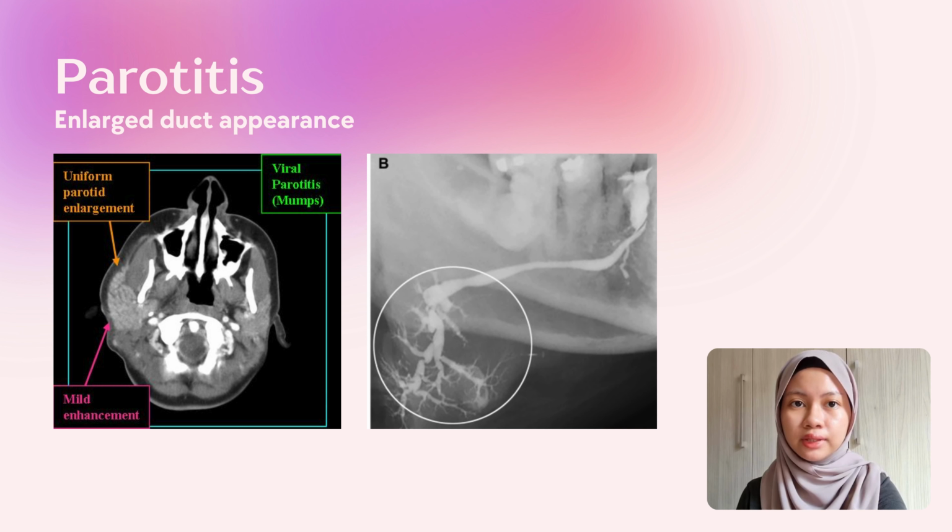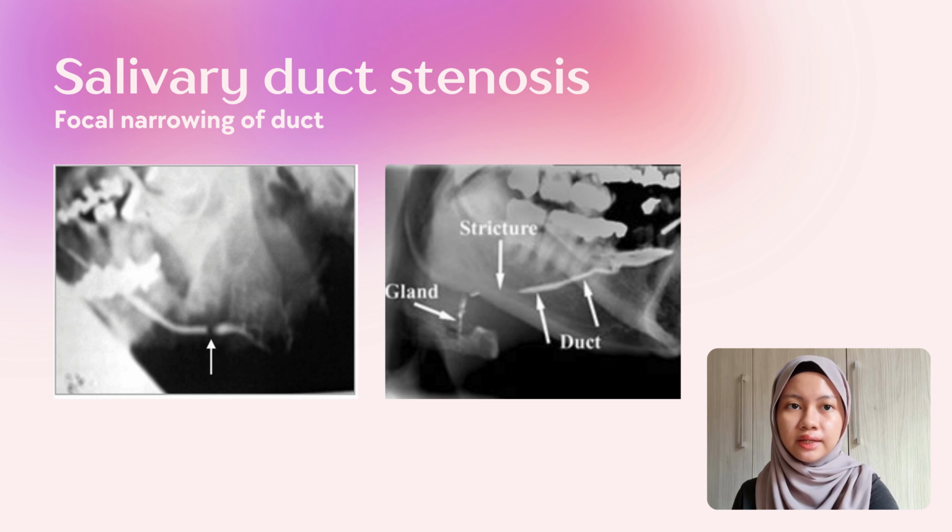Parotitis is a painful swelling of the parotid glands. Here we can see the image shows an enlarged duct appearance. Next, salivary duct stenosis is the second most frequent obstruction, due to the focal narrowing of the duct.